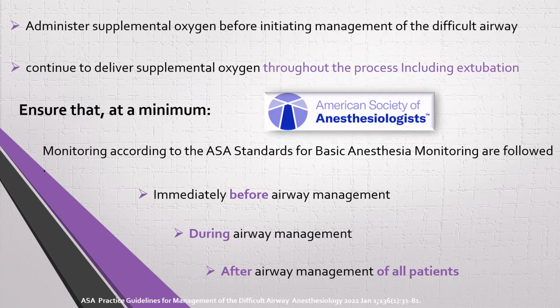The American Society of Anesthesiologists' new guideline recommends giving supplemental oxygen before initiating management of a difficult airway, and continuing to deliver supplemental oxygen throughout the procedure, including extubation. The ASA also recommends ensuring that at least the minimum monitoring according to the ASA standard for basic anesthesia monitoring is followed immediately before, during, and after airway management for all patients.